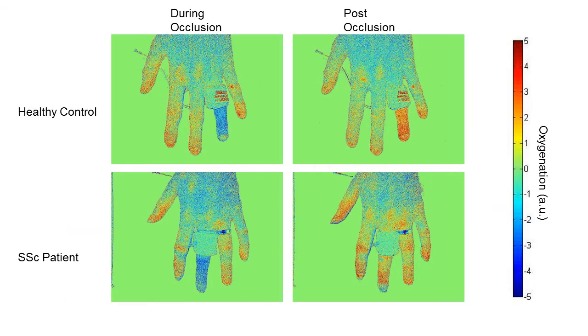Taking a close look, this is what the images look like up close. So these are quite noisy images. Healthy control, drop in oxygen, increase. You can see here we've got a decrease for this diffuse patient, and then we've got areas that increase in oxygen better or worse.